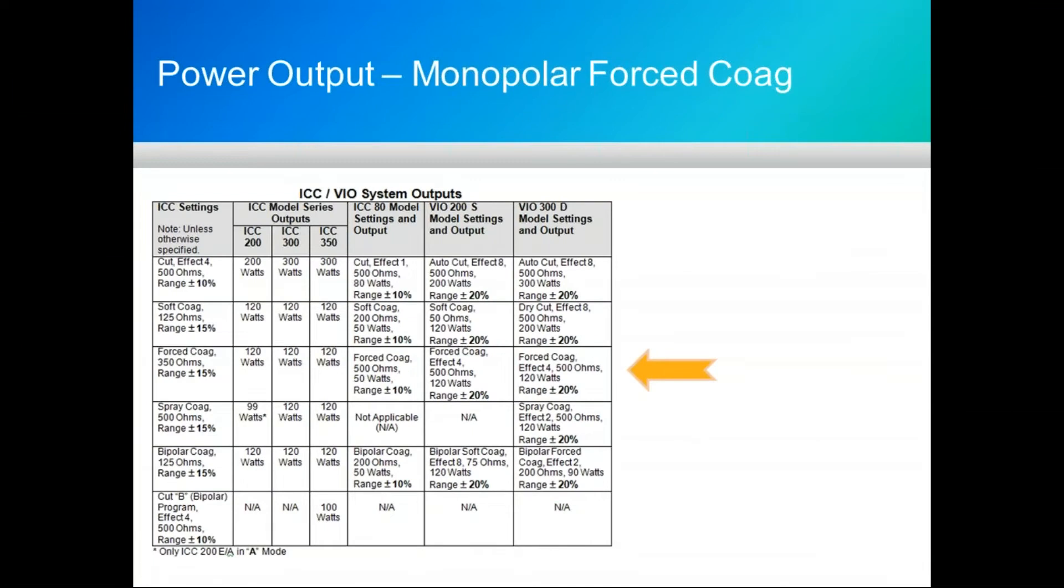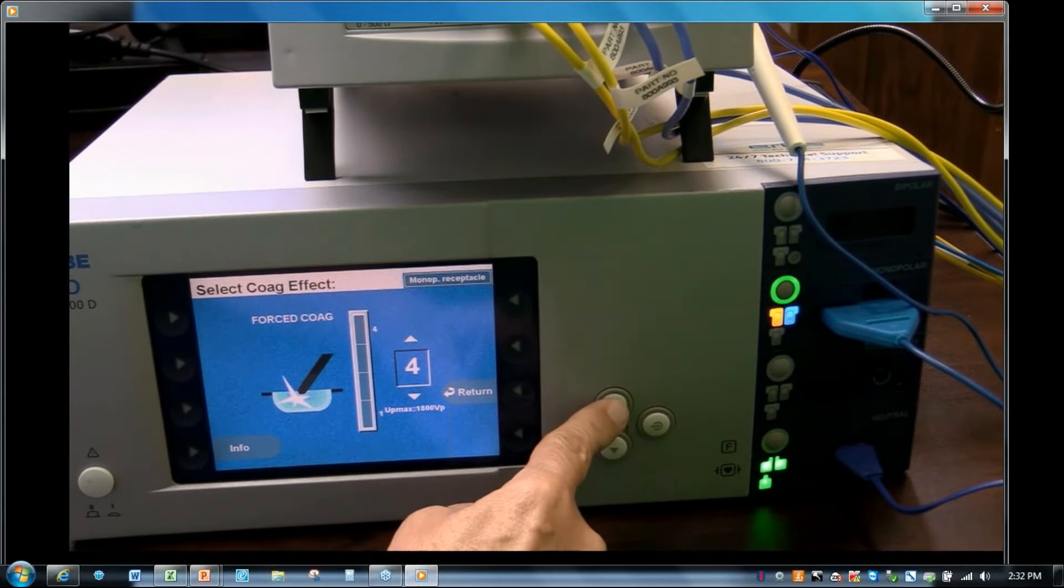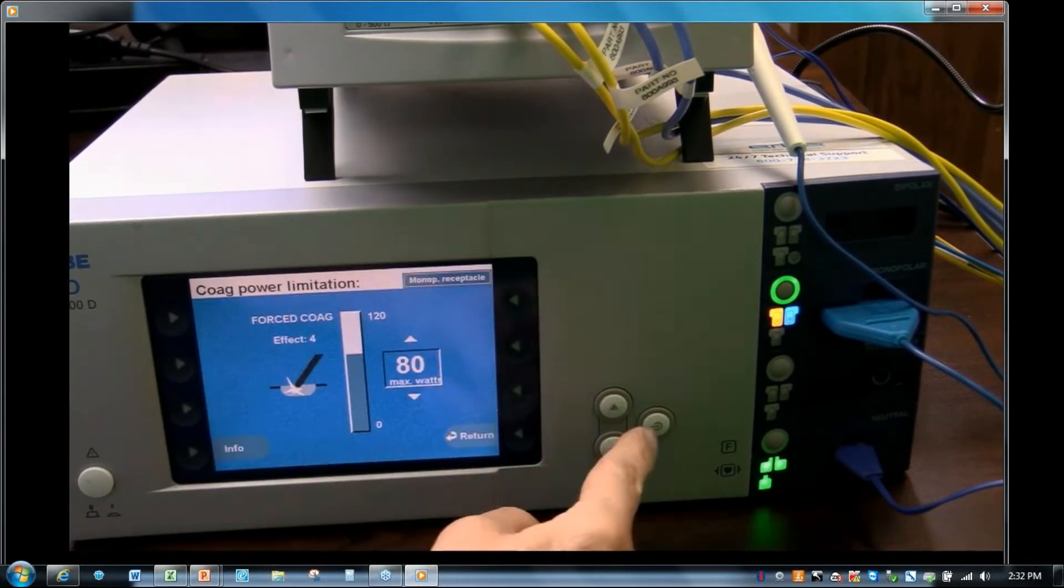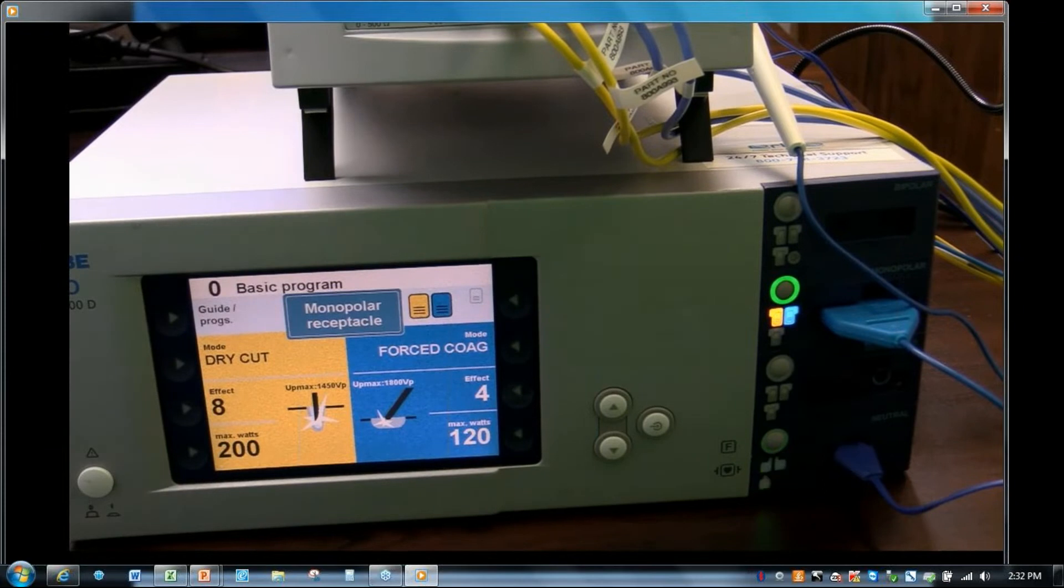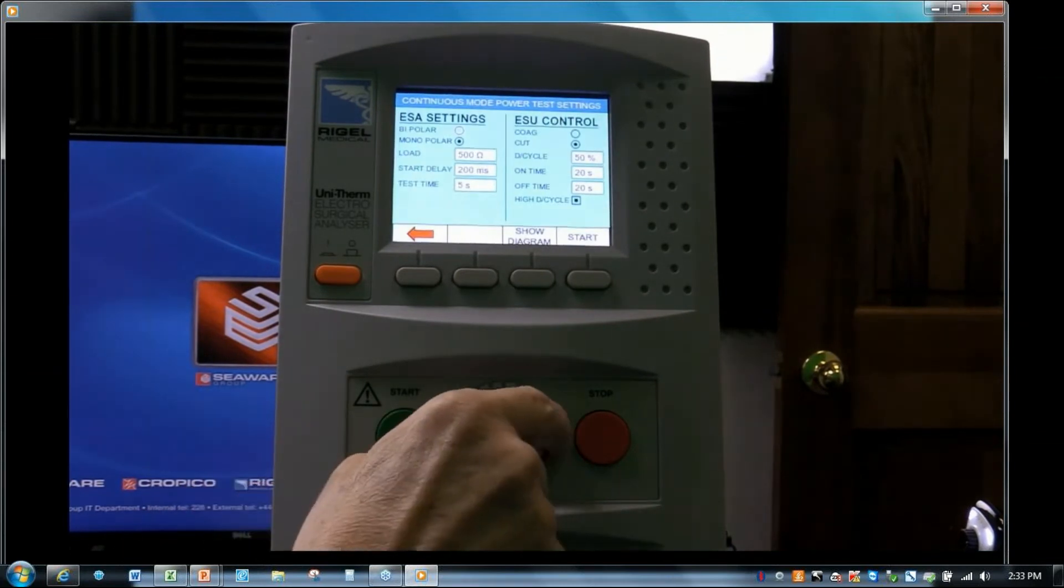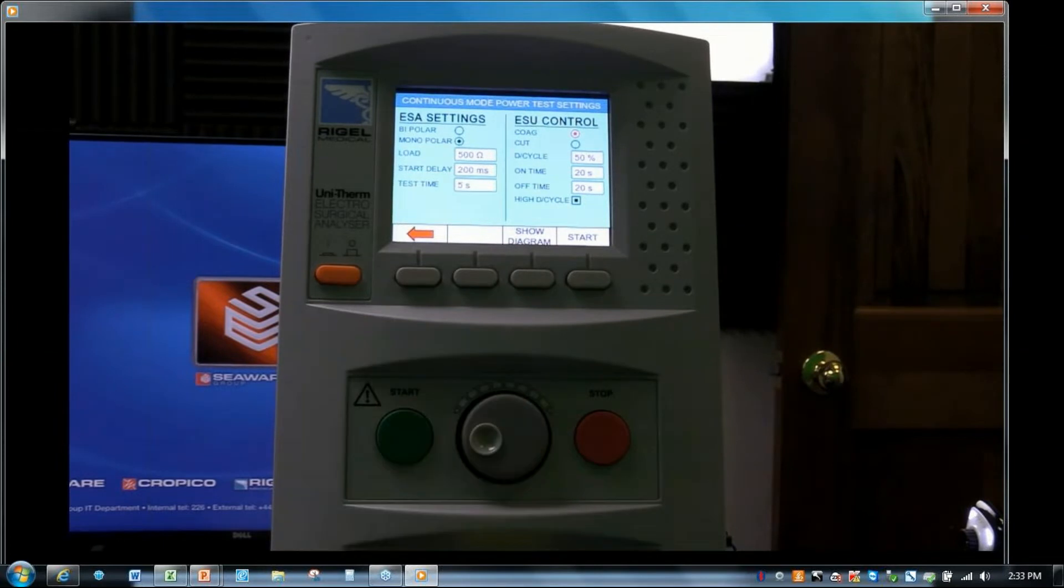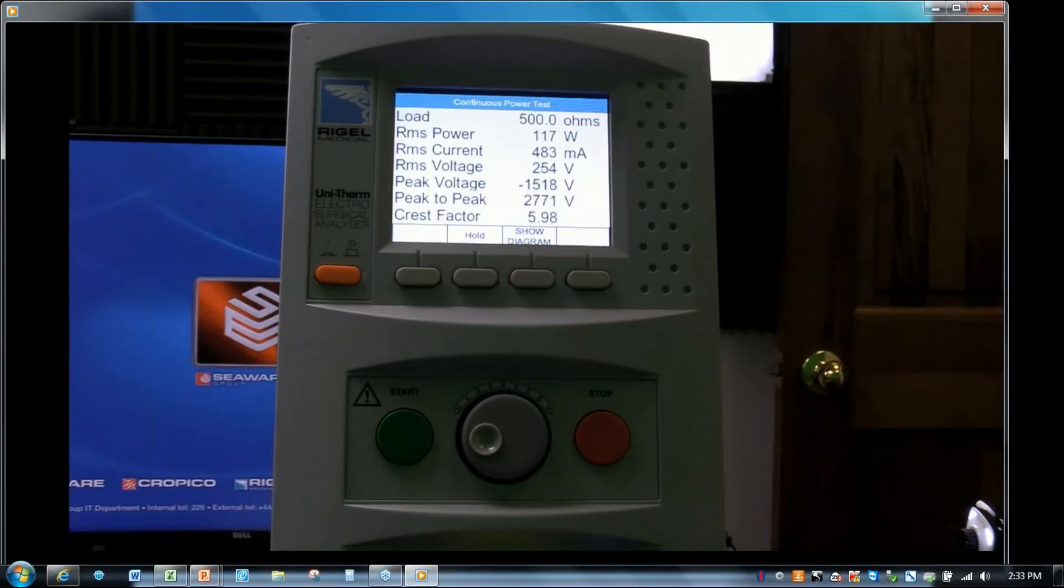Our next test, according to their operational sheet, is force coag. Going to set the effect for 4. Resistance remains at 500 ohms and we're going to set it for 120 watts. Coag settings now on the right-hand side. We're testing at maximum power, 120 watts. Acceptable range is plus or minus 20% for any of the power settings on the 300D. We're measuring 117 watts, well within specification. Also notice how the crest factor is changing as we're going from these various tests.